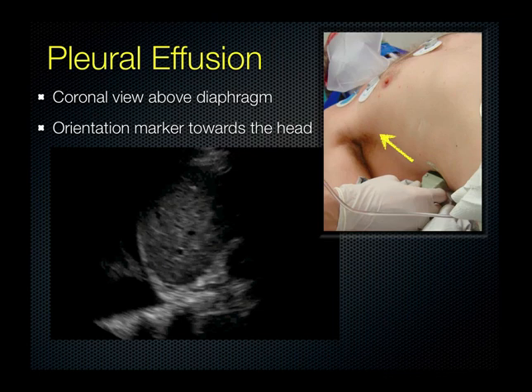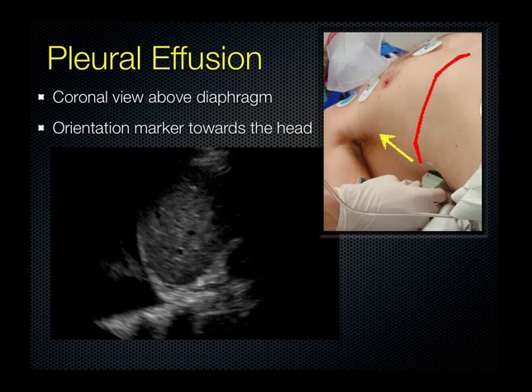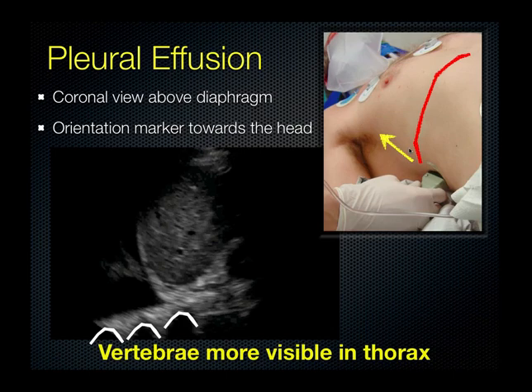Next, we're going to talk about pleural effusions. Here we choose the coronal orientation with the indicator towards the head. We have also chosen the low-frequency probe so we can get a deeper view. Here's the diaphragm — you'd like to place your probe at the interface where the diaphragm separates the thoracic from the abdominal cavity. You can also notice that the vertebrae are more visible in the thorax when there is fluid in the lung, because pleural fluid conducts ultrasound beams while air does not. Structures deep to the fluid are enhanced — we call this posterior acoustic enhancement.